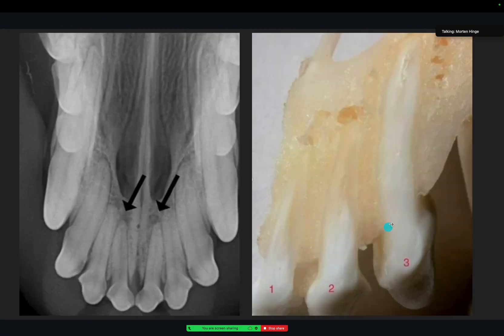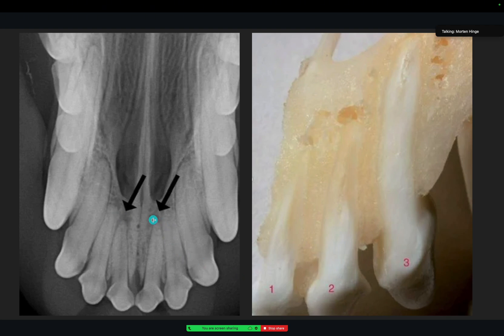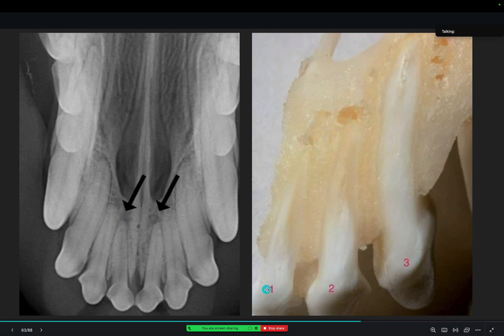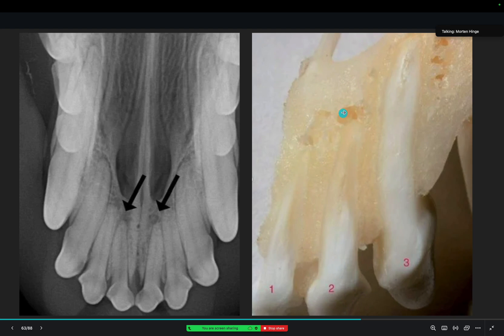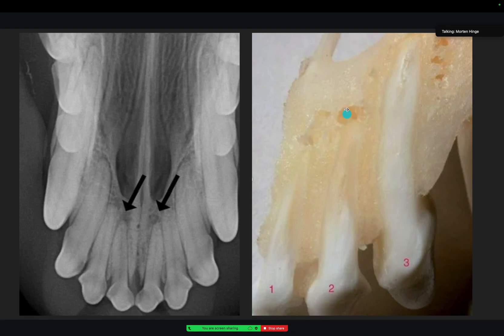In incisors, you may be in doubt sometimes because these two incisors look like they have a lucency around them, and it could easily be said this is an abscess or a granuloma or a cyst, so we have to remove them. But again, they're not discolored, there are no signs of trauma, the pulp canals are the same width as the adjacent teeth, so they ought to be normal — and they are, because if you have a cross section of the bone, you will see normal structures here that are round. It's not an abscess.